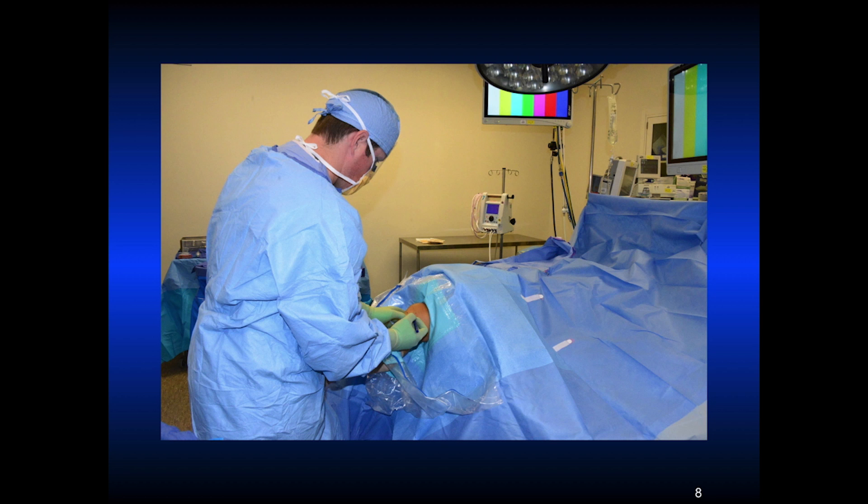The portals are very key. I make my portals at 30 degrees of flexion. If you make them at a different degree of flexion you just have to put the scope or the cannulas back in at that degree of flexion, because the skin will move on the underlying structures. At 30 degrees of flexion, the landmarks are the inferior pole of the patella and just lateral to the patellar tendon. Typically the lateral portal is about a centimeter superior to the medial portal, which is made under direct visualization.